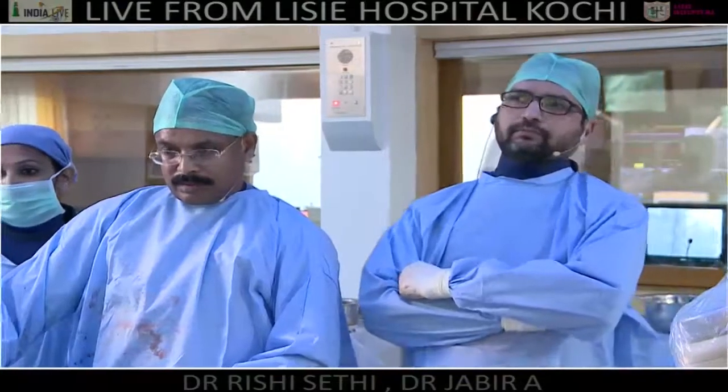Anyway, FFR has been negative both in OM as well as RCA. You can put the same wire and measure what is the FFR across the distal circumflex. He's done that already. He's done everything. The FFR was 0.89. The IFR was 0.89. That is the problem. There is no doubt.